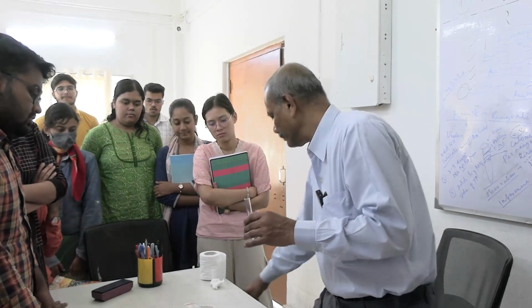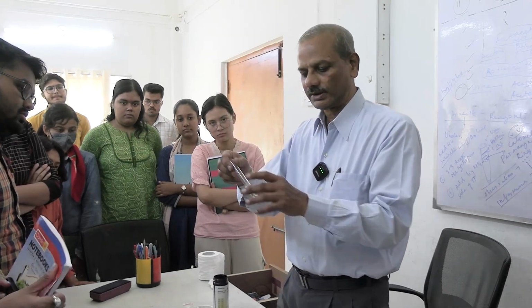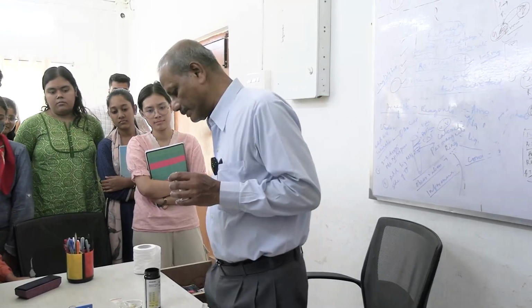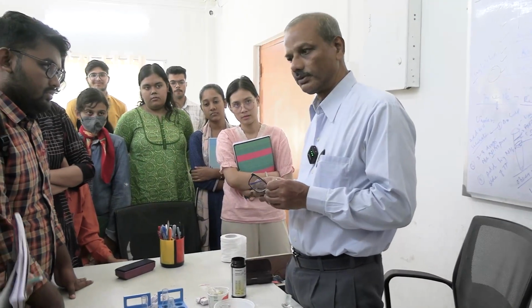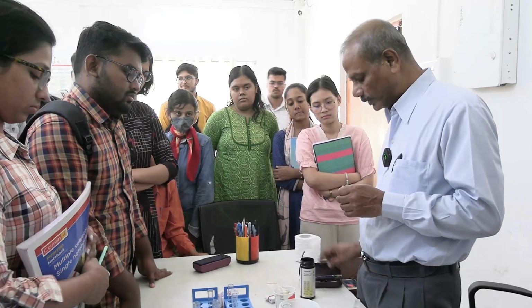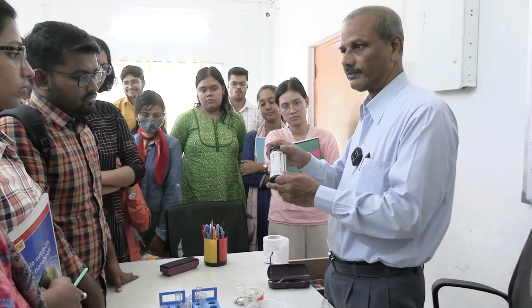Dipstick will be there. Just as I told you earlier, right now I am demonstrating this one. This cumbersome procedure is not done. There is a simple procedure to do this. I told you one strip can be for glucose only. Normally glucose-only strips are not available in the market; one type of multi-strip, glucose and protein, is available. Or the 2 parameter. And another has all the parameters which you will be testing.